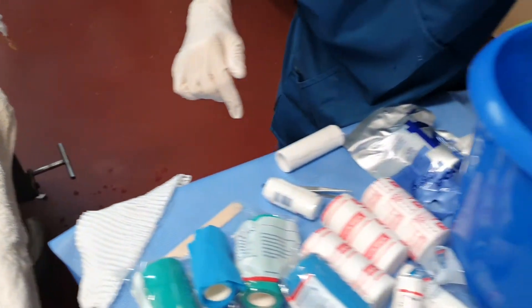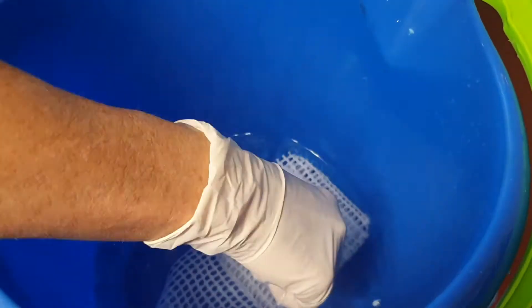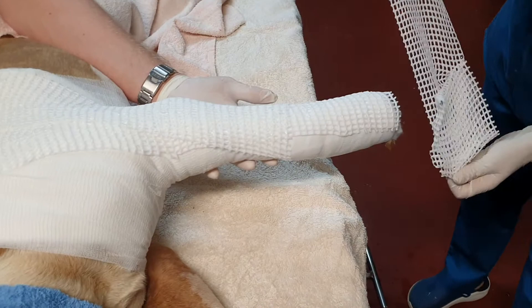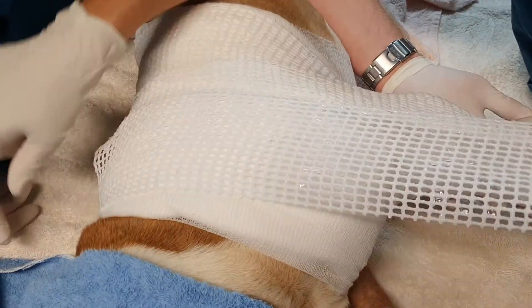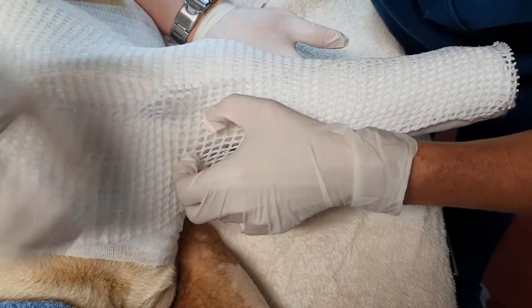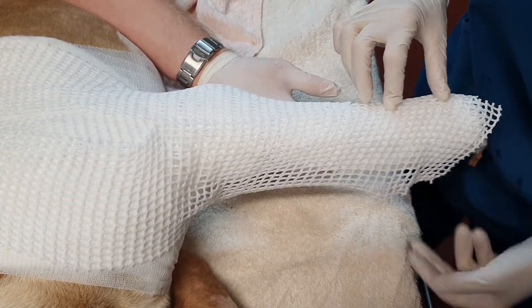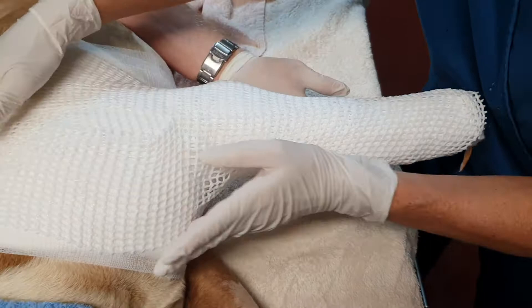Let's go for our third layer. One end was sitting out of the water so it's not soft yet. Make sure that you include the point of the shoulder, especially if you have a fracture of the humerus you're trying to stabilise. Make sure it fits nicely around the point of the elbow. If I got to this stage and thought that's not going to be any good, I'll just pull this layer back off and throw it back in the hot water until I'm happy. I think that looks pretty good.